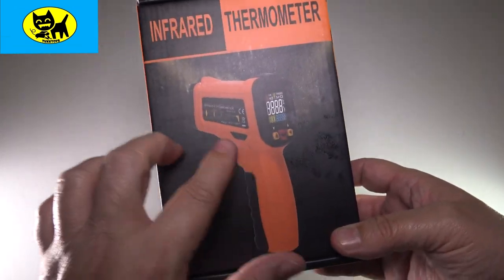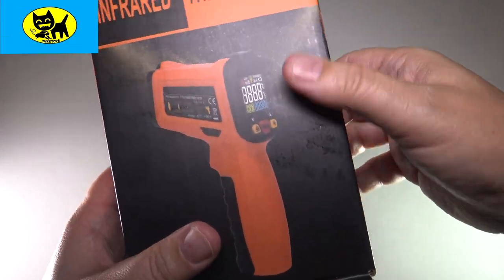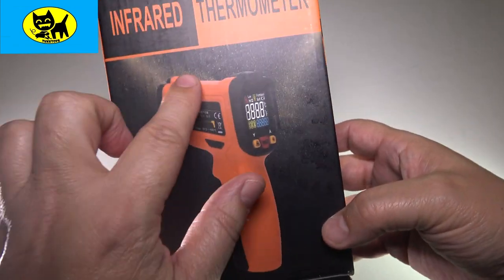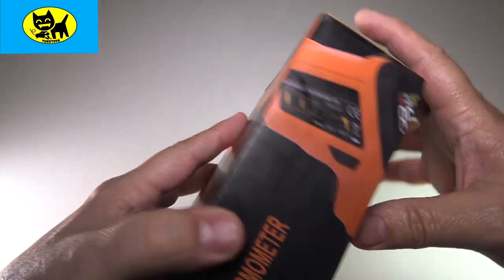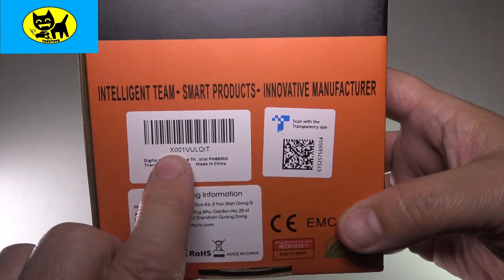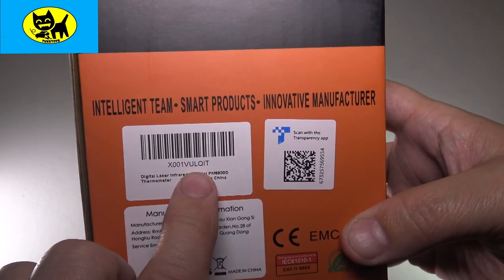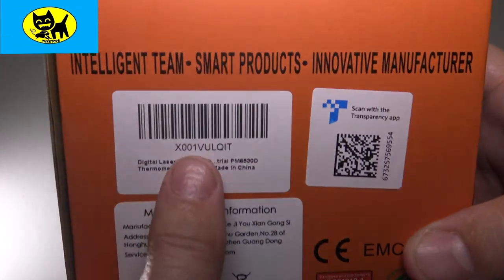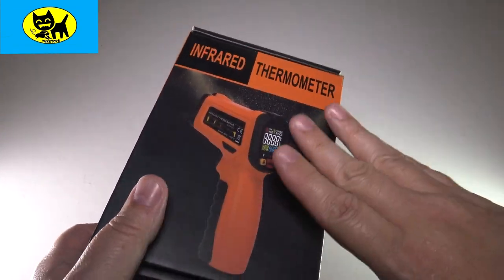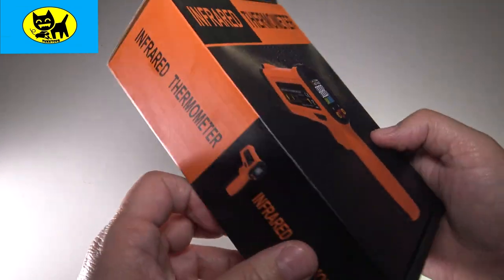I got some fingerprints on here — the hand sanitizer is making my fingers a little shiny. It comes with a matte black look to it, nice picture of it on the side. This is the infrared thermometer, model X-001-V-U-L-Q-I-T. There's a barcode but we'll have a link for the best price down below — I'll be watching to make sure you get the best deal.